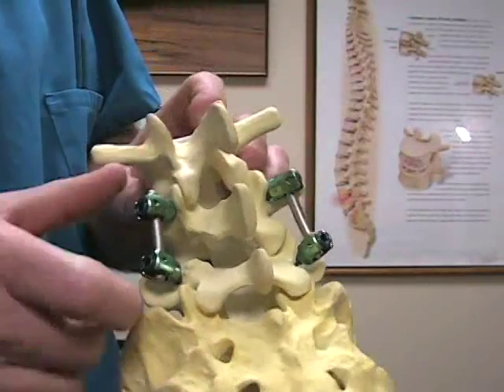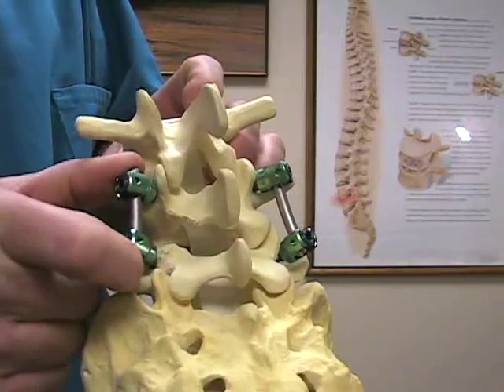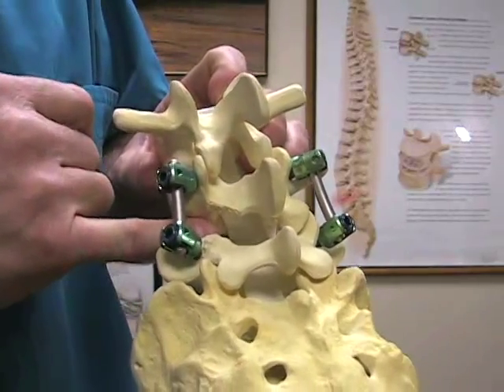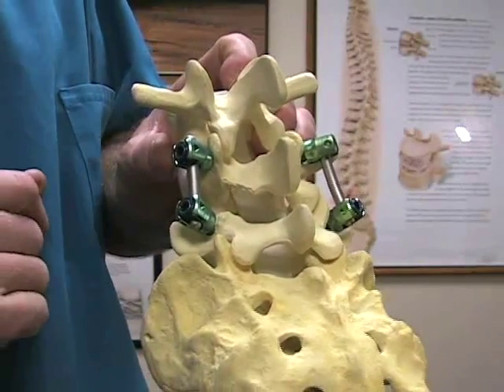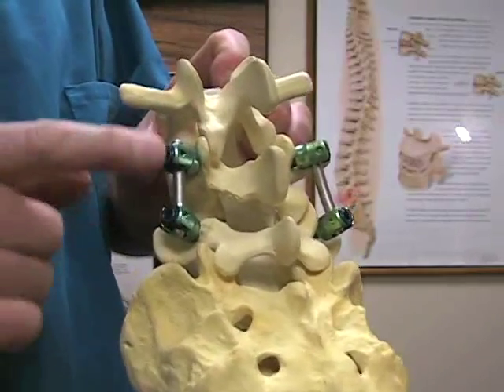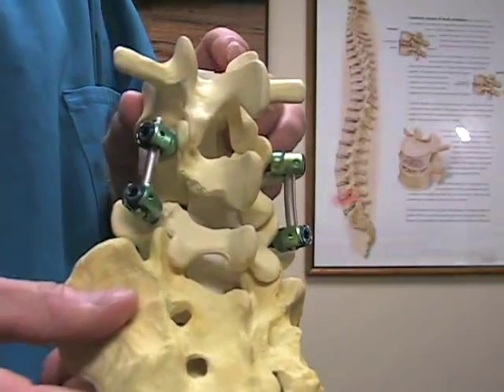Now, what these do is hold the spine steady during the time that there's going to be a fusion. If all we did is remove the bone here, put the implant in, and didn't put these pedicle screws and rods on, then there would be a much higher chance of further instability and slippage of the spine. So by adding these pedicle screws, it holds the spine still during the time that it fuses.